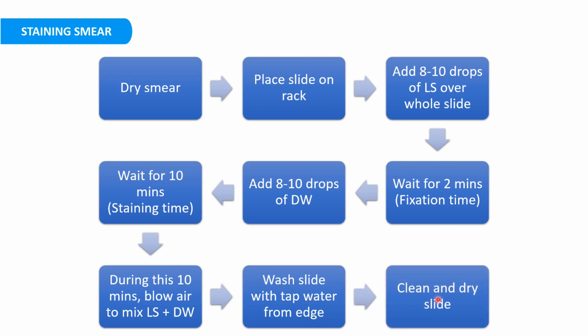And then clean and dry the slide. You have to clean the back side of the slide, not the slide portion where the smear is, but the other side of the slide where the smear is not there. You have to clean with the cotton and then dry the slide. You have to completely dry the slide before examining under the microscope. So these are the steps.